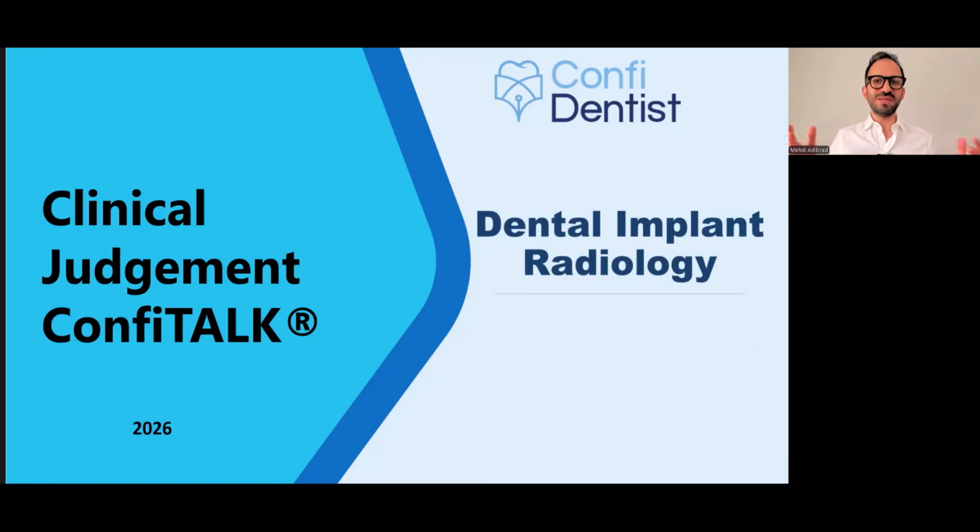You should be able to evaluate the implant on the X-ray in terms of the type of the implant, the type of bone loss, whether there is a bone loss or not, how much is considered acceptable, how much is considered concerning, and based on the clinical findings and the radiographic findings that you have, come up maybe with a treatment plan, which can be asked, as I said, in both ACJ exam and later in the situational judgment.